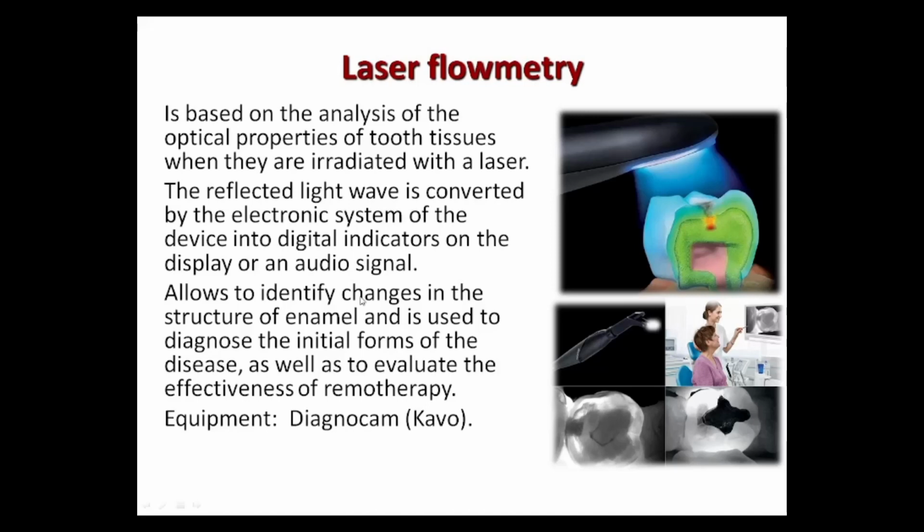And equipment which is used for laser flowmetry is Diagnocam by KaVo company.